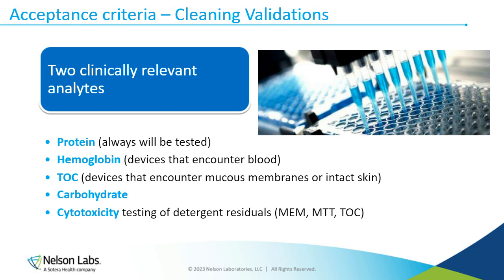Cytotoxicity is a recommendation, but we see it almost as a requirement now, that you have to analyze that there are no detergent residuals left after the cleaning validation. And that's done through a series of different tests, and you can decide what test is appropriate for the testing. We usually do MEM, but there is MTT and TOC. TOC is a very good candidate for that test as well.